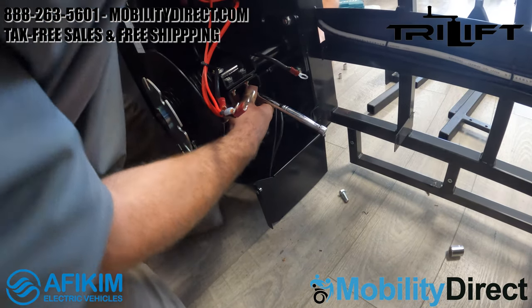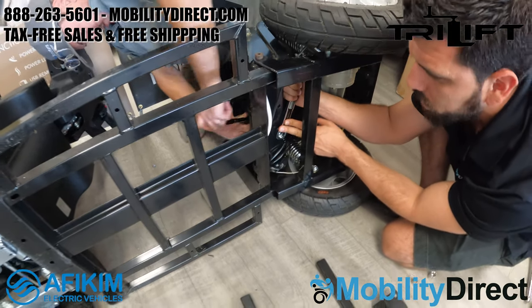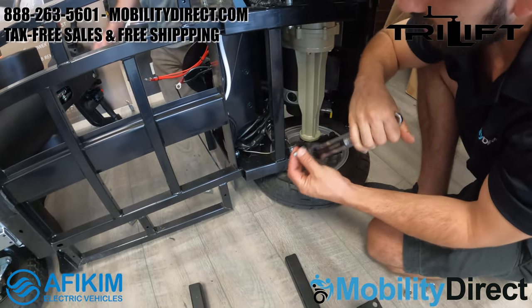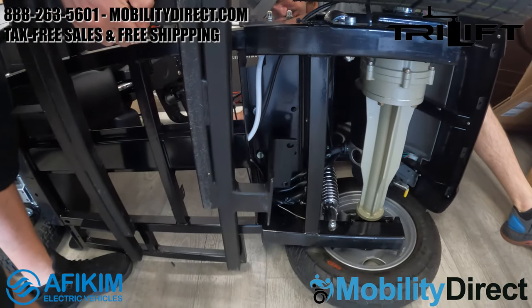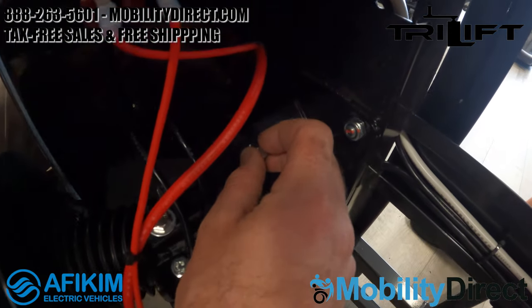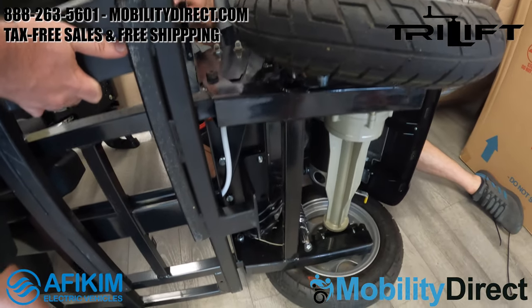Once you have those two bolts out, you'll need to line up the tri-lift bracket so that the holes on the bracket — which are meant to go up in there where the seat post bolts have been removed — are lined up. Then you just reinstall those bolts with the tri-lift bracket lined up so that the two holes are aligned with the two holes for the rear side of the seat post. Those heavy-duty bolts securing the seat post to the frame are now going through the back side of that tri-lift bracket.